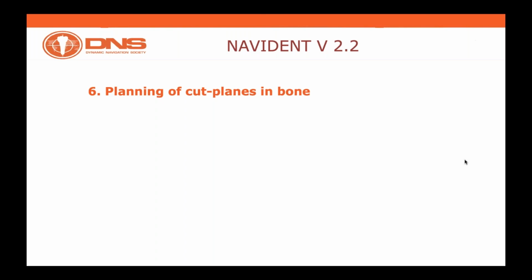That opens up another opportunity of investigation, which I think is worth exploring, because the corticectomy carried out by using a piezo is another quite important achievement for the patient.